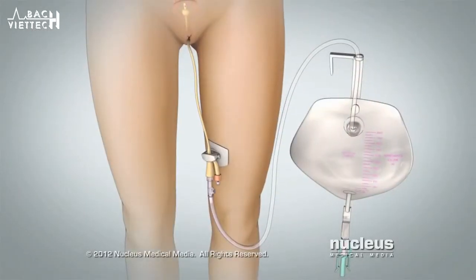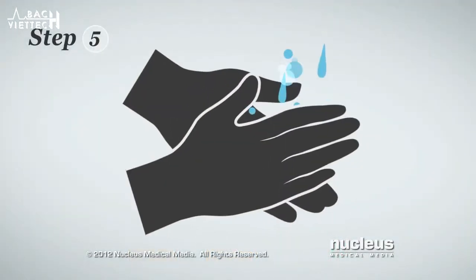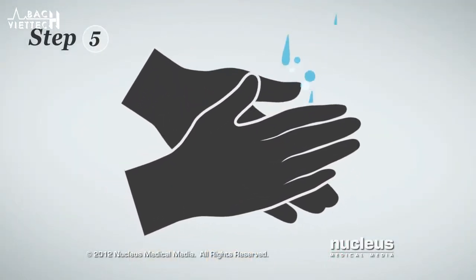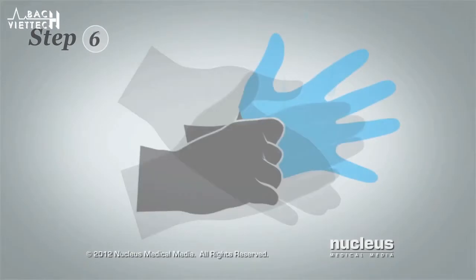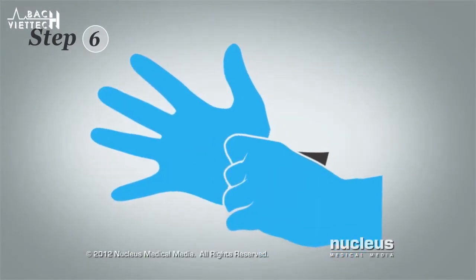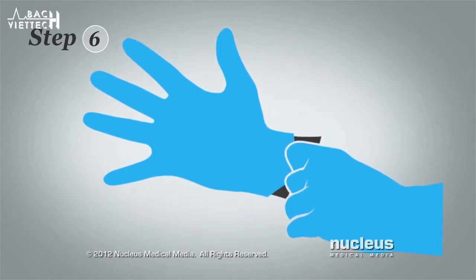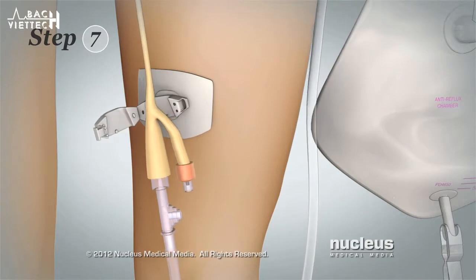Now you will begin removing the catheter. Step 5: Wash your hands with soap and water again and then dry them. Step 6: Put on disposable gloves. Step 7: Unclip the catheter from your leg.